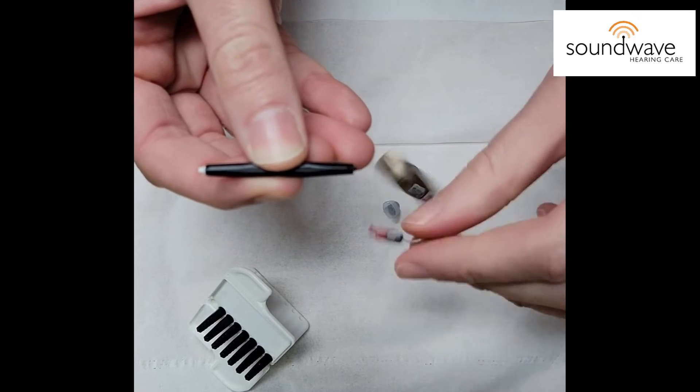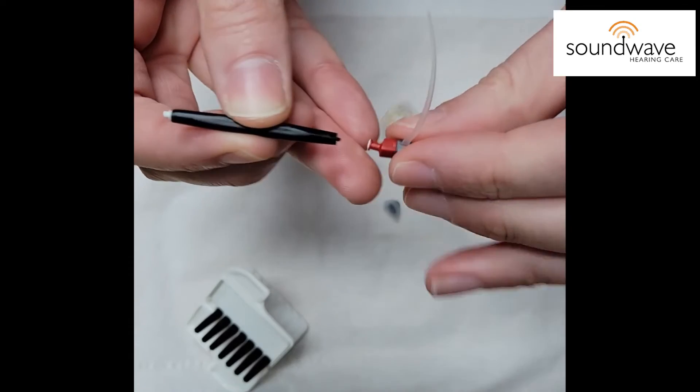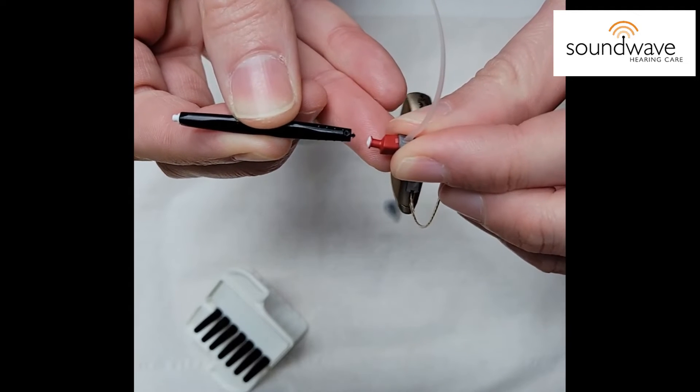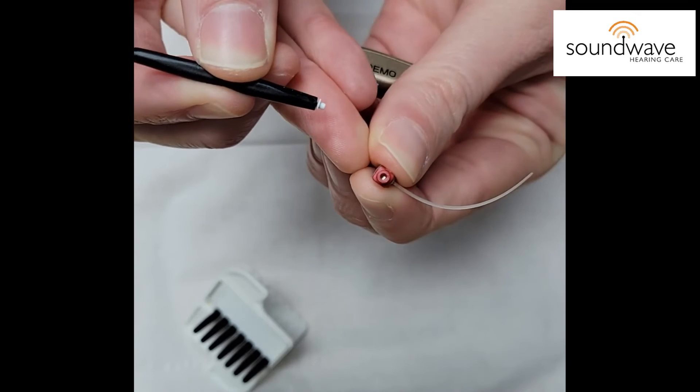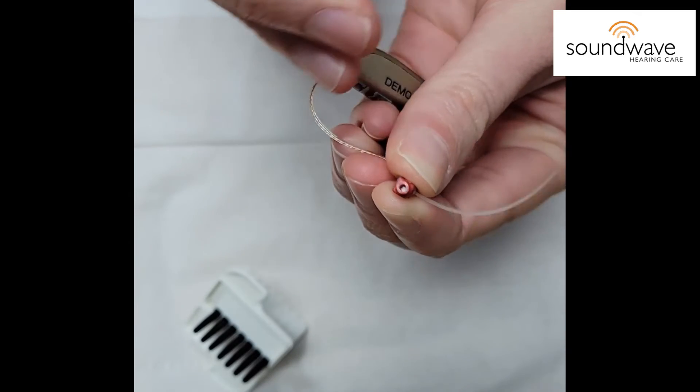What you need to do is you're going to hold the hearing aid firmly and with the sharp end you're gently going to push in and pull out. As you may notice the filter has been removed from the hearing aid.